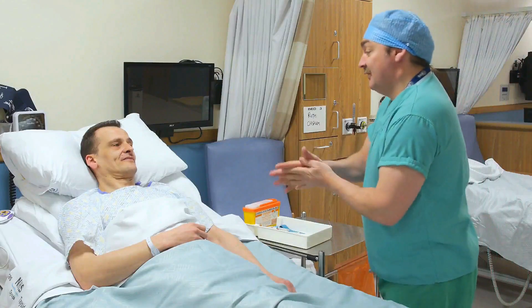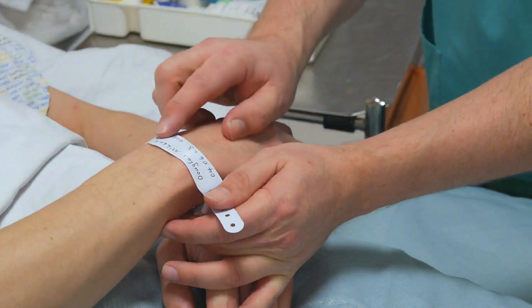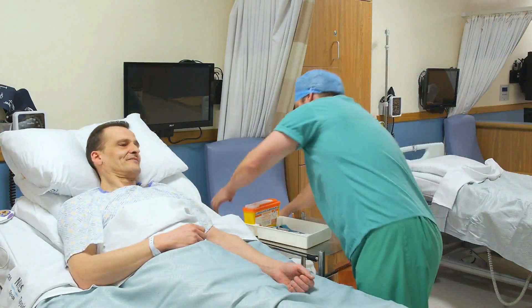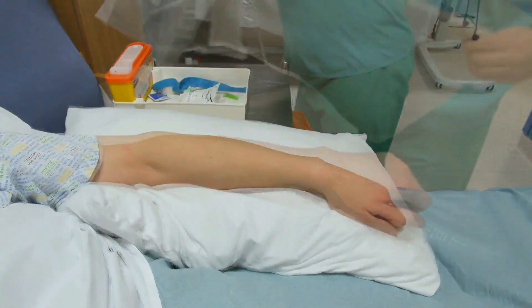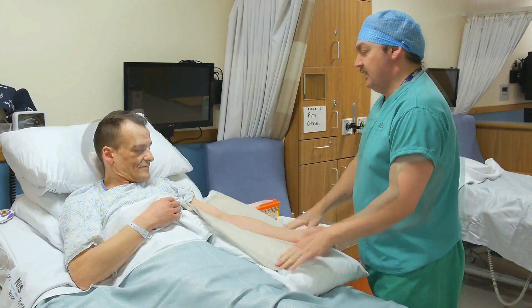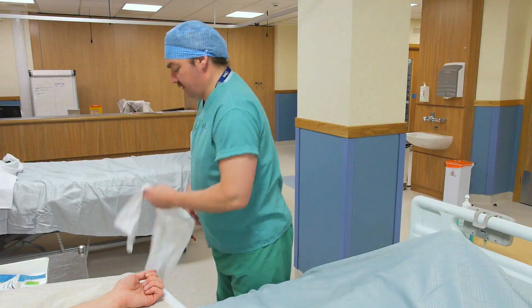Decontaminate your hands. Introduce yourself to the patient. Confirm identity looking at the name and date of birth and explain the procedure. Having gained verbal consent and checked for allergies, ensure there is adequate lighting and support the chosen arm on a pillow. This is normally the patient's non-dominant arm. This will ensure patient comfort and facilitate venous access.